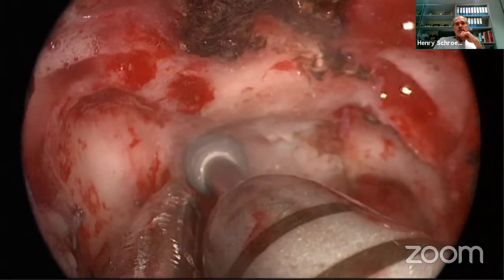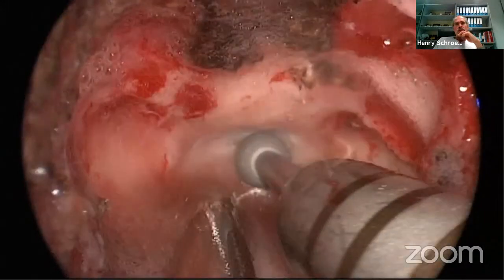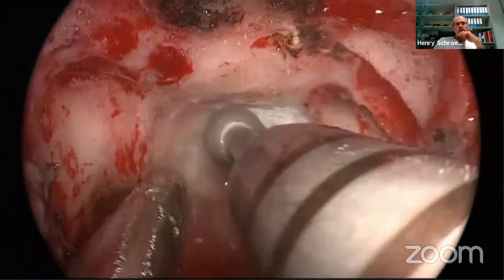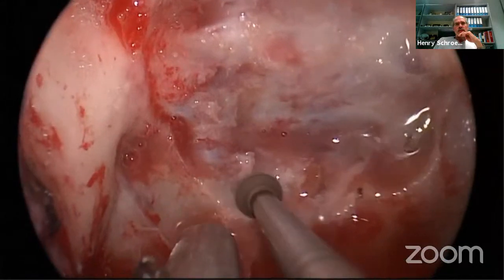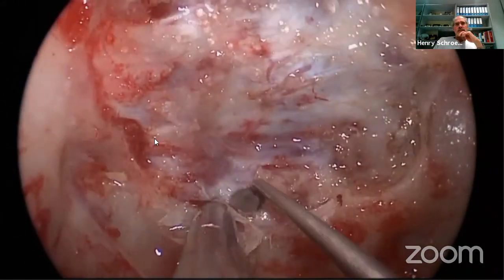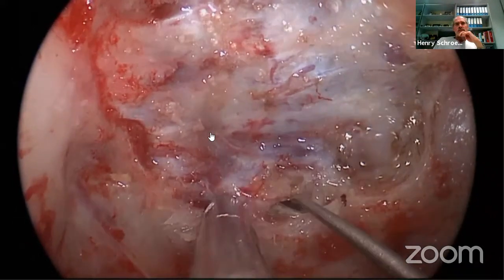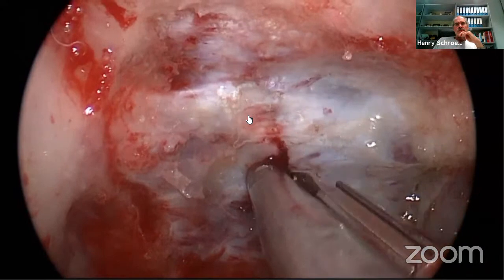So at first we drill the skull base, the tuberculum. We unroof the carotid because the tumor was located in this area. You see the right carotid here. Open the dura.